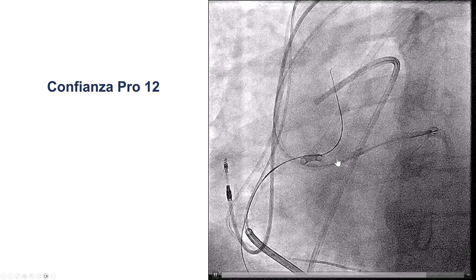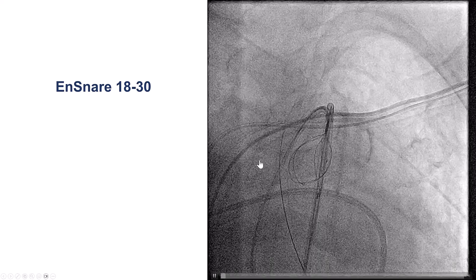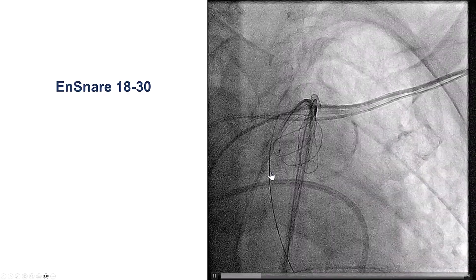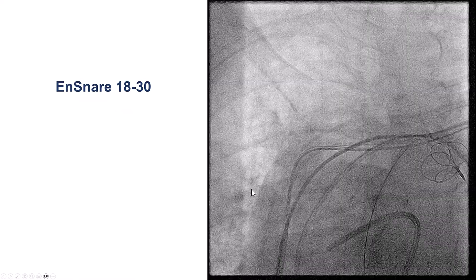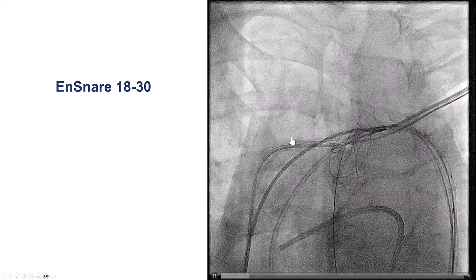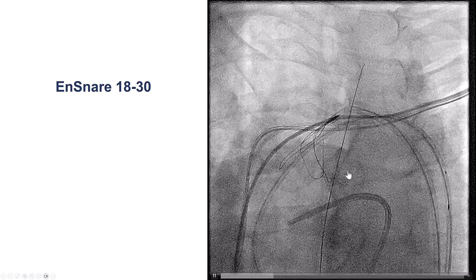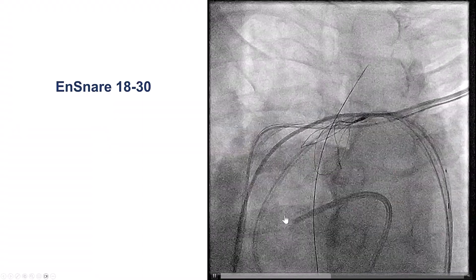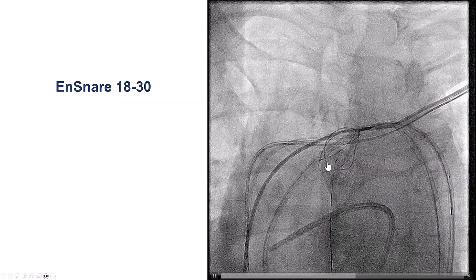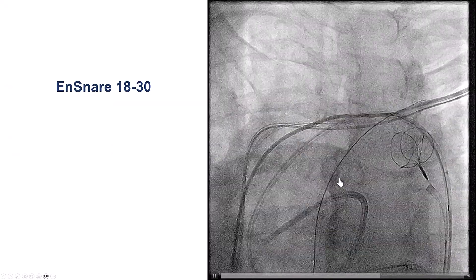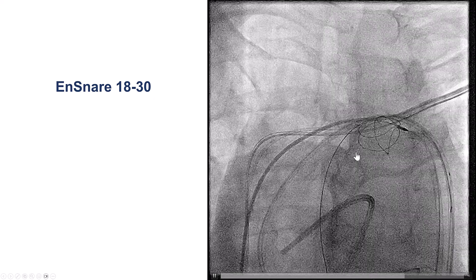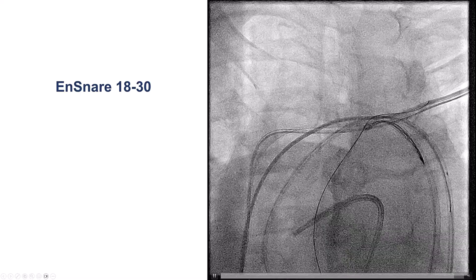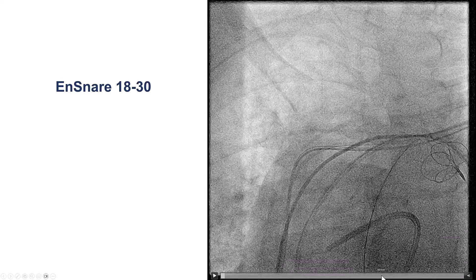Unfortunately, we could not get it into the guide catheter, so we decided to use a snare. We used an 18 by 30 mm ensnare, and we did have some difficulty — we see that we're in a different plane with the ensnare and the guidewire. Sometimes one can get things done into the brachiocephalic artery, but here it was fairly challenging. We brought the snare back and tried different approaches, pulling the wire back and advancing it while the snare was opening and closing. Eventually, we were able to capture it and have it into our snare.